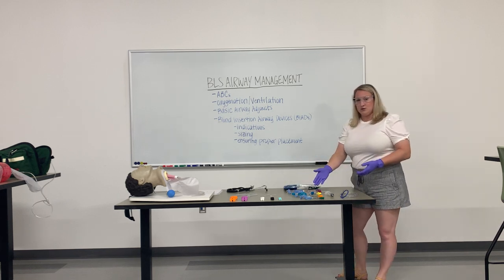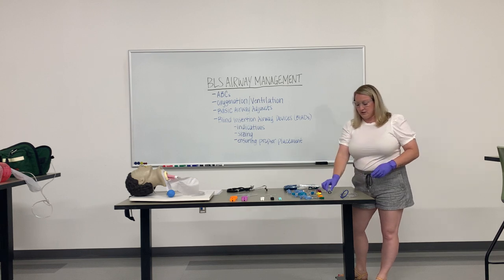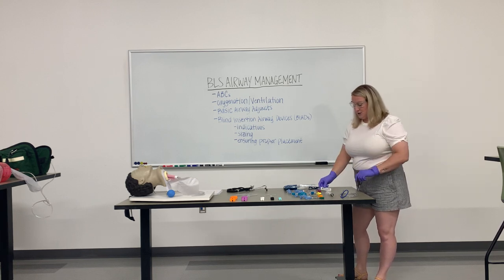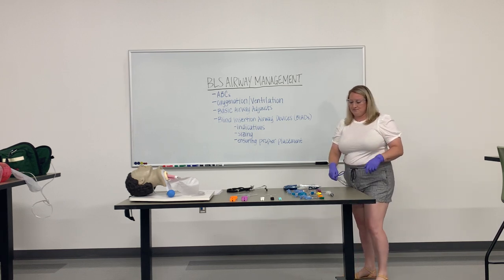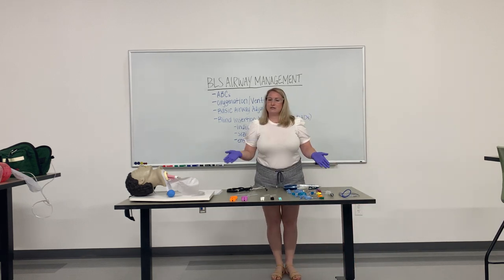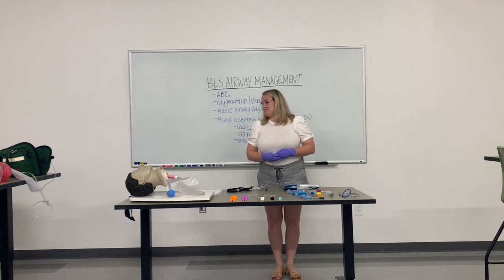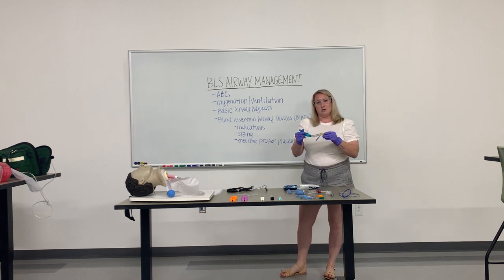Inside the package you will obviously have your king tube, your 60 to 80 cc syringe, your lubricating jelly, and an OG — oral gastric — tube. For this mannequin, we will guess they are an individual from 4 to 5 feet, so we're going to try a size 3 king tube.